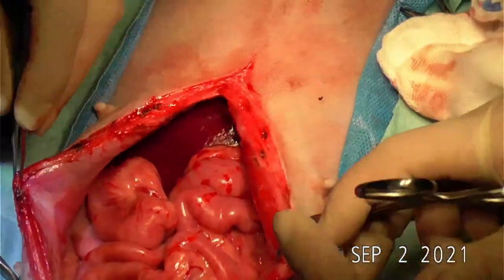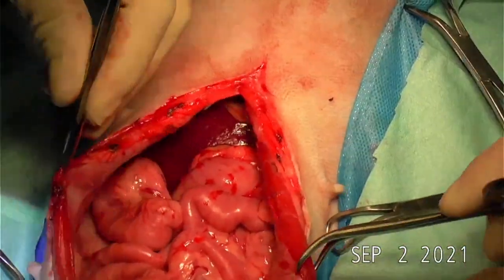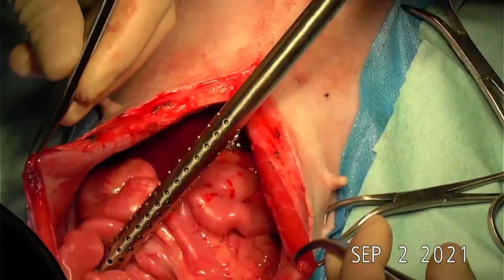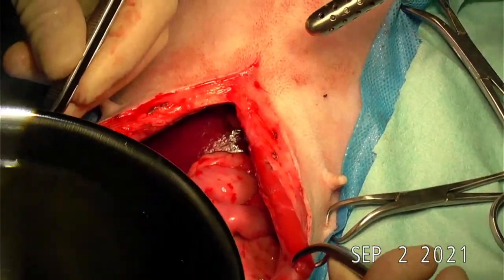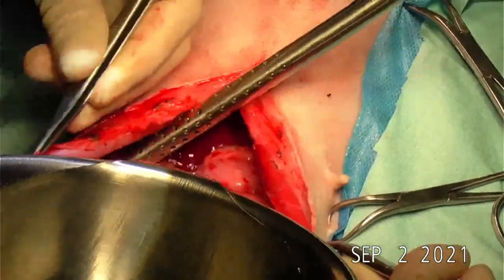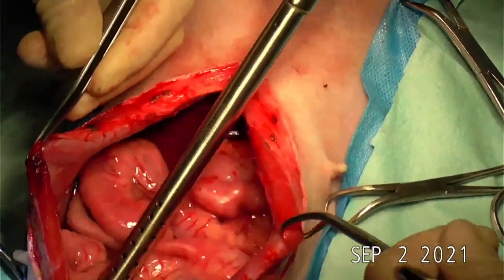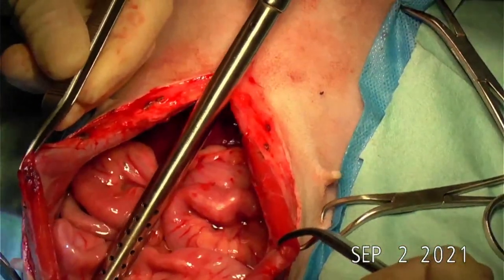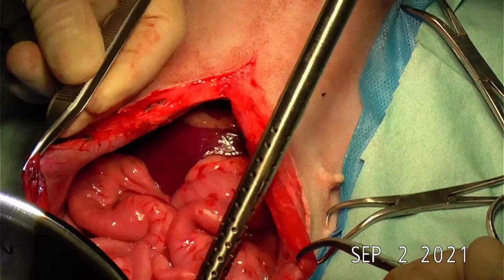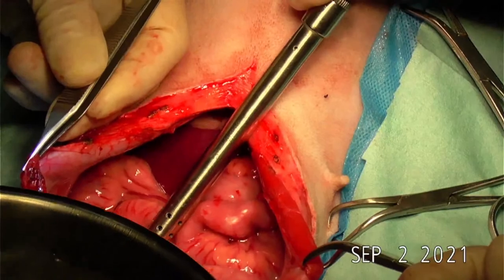Then the second purpose of warm saline lavage, aside from dilution, is that you will be able to check if there is active bleeding. And third one is, since you're using a warm saline, it helps warm up the body and helps prevent hypothermia.